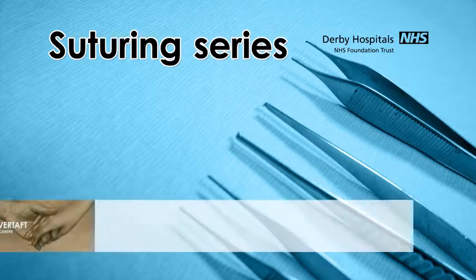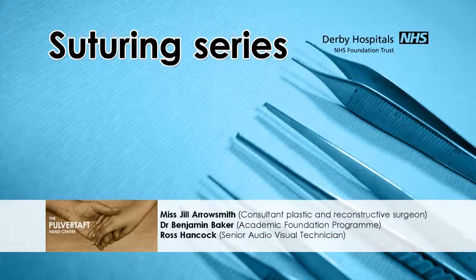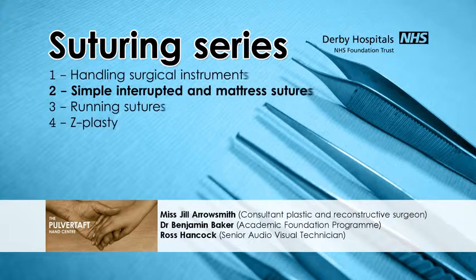My name is Benjamin Baker, I'm an academic junior doctor and I'm delighted to welcome back Miss Arrowsmith, a consultant plastic and reconstructive surgeon with a special interest in hand surgery here in Derby. Today is the second of our 4 podcasts about suturing techniques, and we've been privileged enough to have the opportunity to demonstrate these on cadaveric tissues.